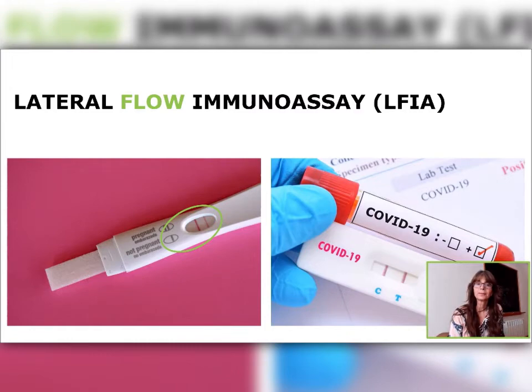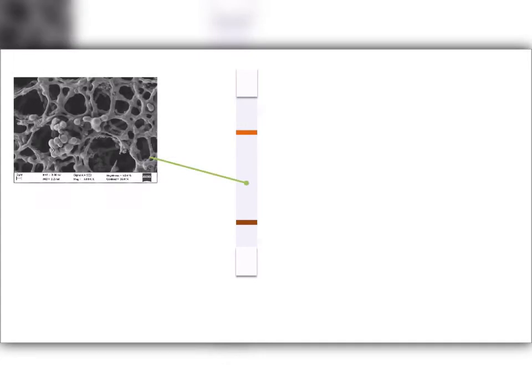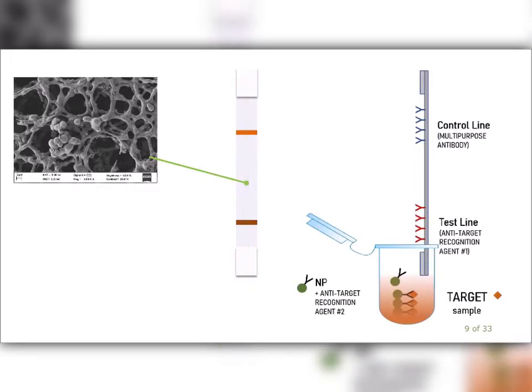But first, how does a rapid diagnostic test work? The lateral flow immunoassay is a paper-supported system. It basically consists of a long strip of nitrocellulose membrane that acts as microfluidic platform, guiding the liquid sample by capillary action. We print a line of a biorecognition molecule across the strip. This is usually an antibody that selectively captures the molecule of interest. Then, a second line in which we use a non-selected antibody to capture anything biological that passes by.